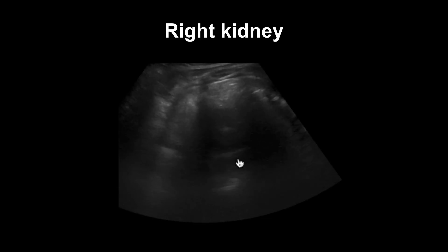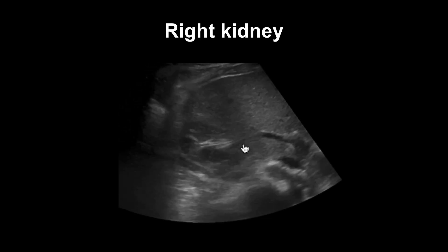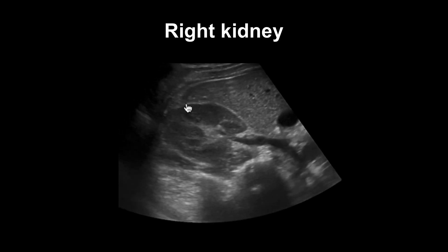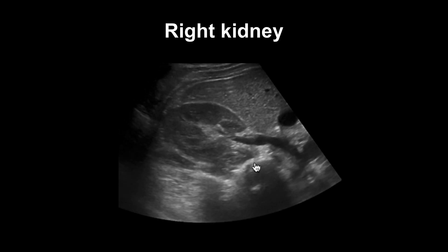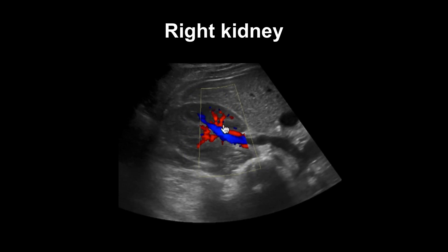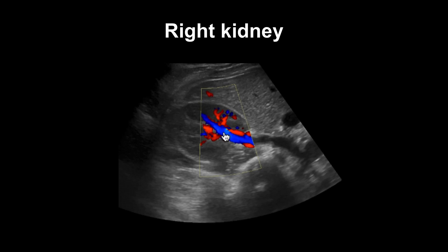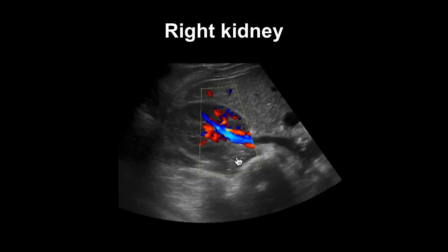Now we go into a cross section, and we can see the Morrison pouch right here. And if we put on the Doppler, we can even distinguish the different vascular structures going into the kidney, with the vein being blue and the artery being red.